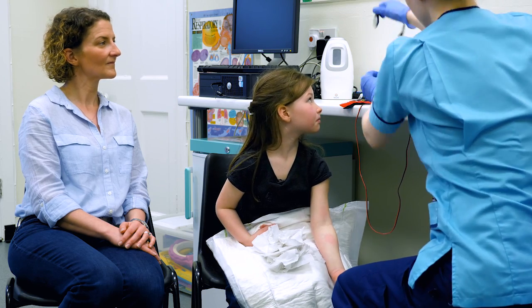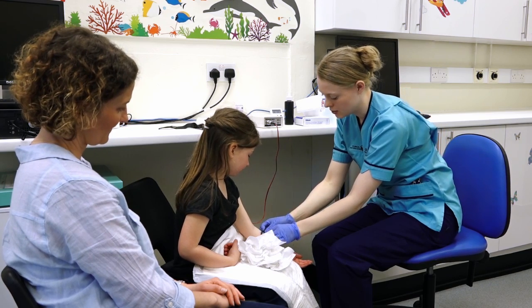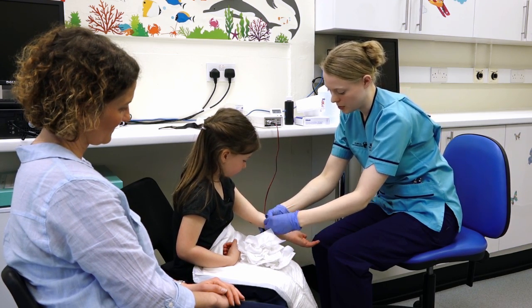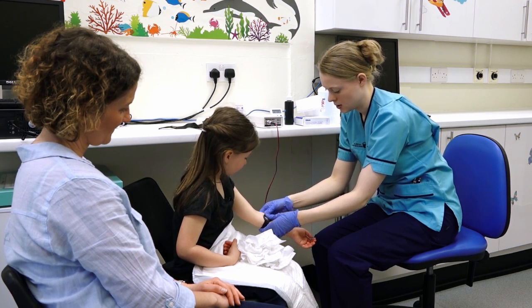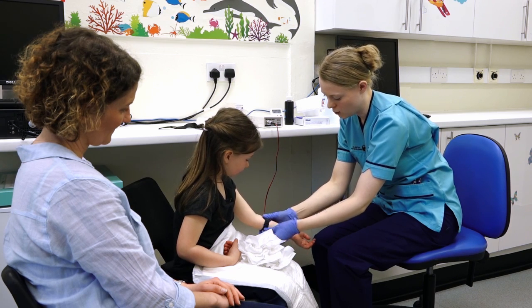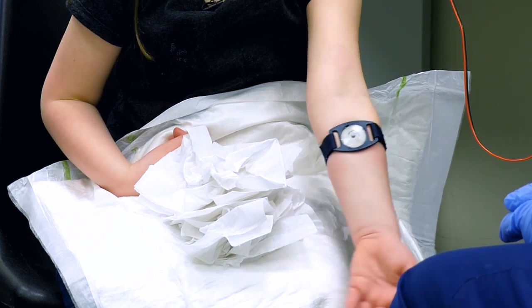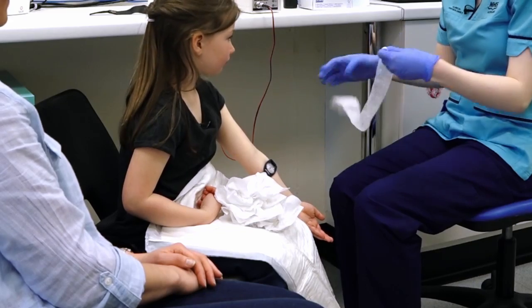Now we can put our little collection device on — it looks a wee bit like a watch — and it's just going to go onto your arm like that. I'm going to strap it on; it might feel a wee bit tight, but that's just so that we can get all that sweat collected up into there. Would you like a bandage to cover it up? Yeah. Put a wee bandage on.